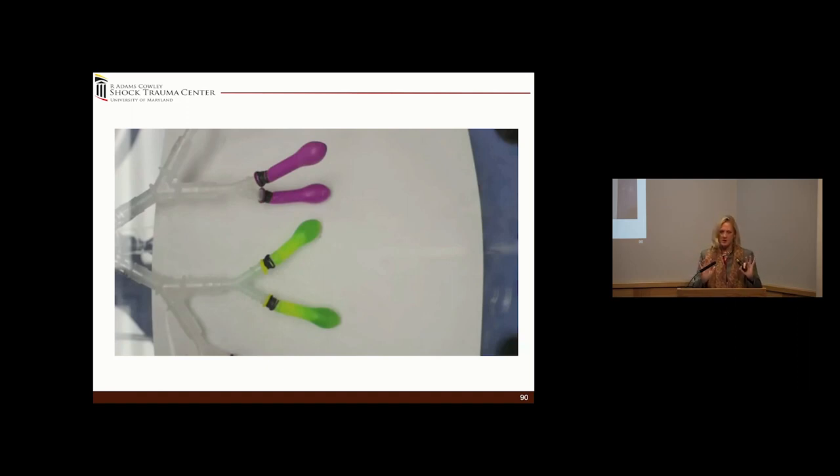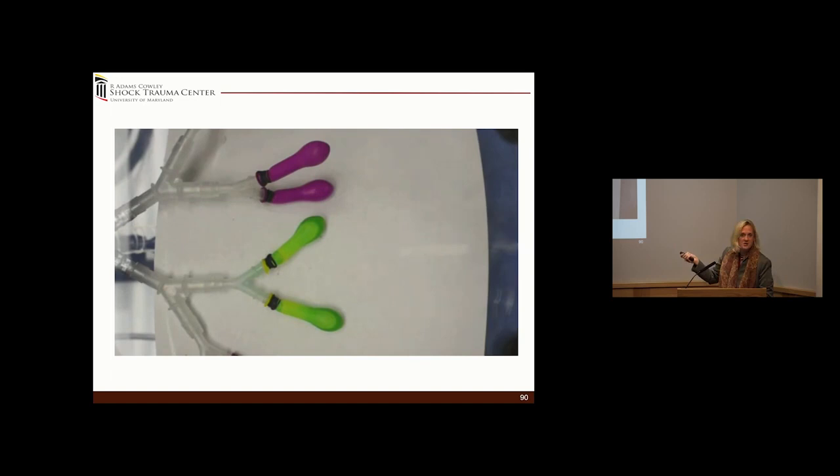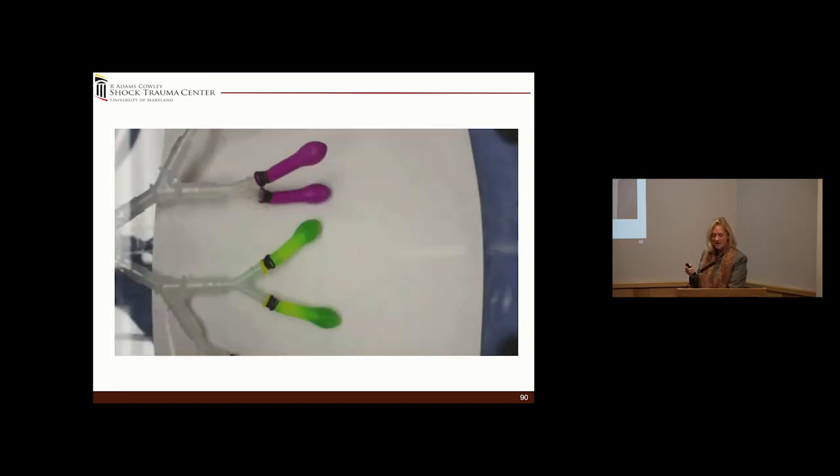No difference in airway pressure, no difference in rates, all right? But what you're going to see is this is the pressure control, and you can watch here. You can see the little vibration here, and you can see it kind of moving down a little bit, but it's all still stuck there, okay? This is the pressure control 1-to-1. So for the exact same time frame, we're going to now switch over to TCAV. And this is the exact same amount of time.